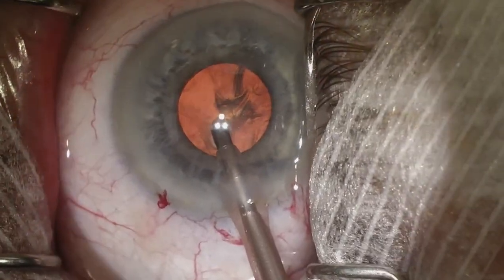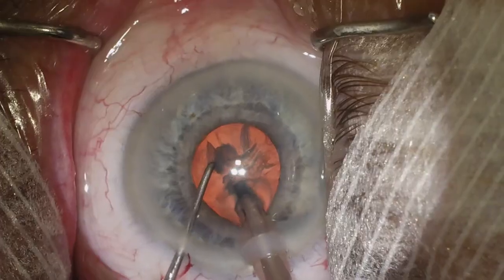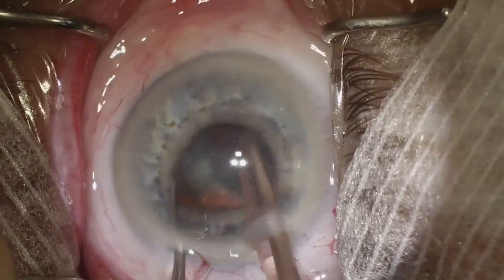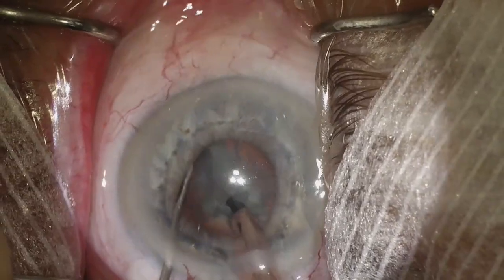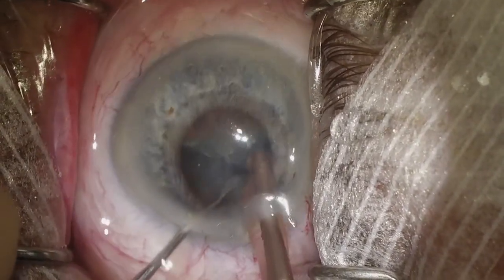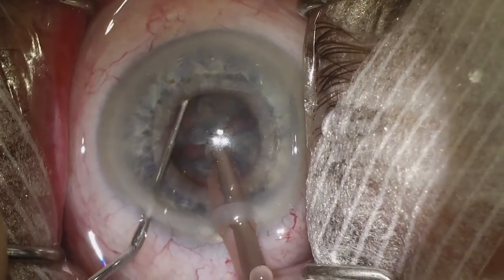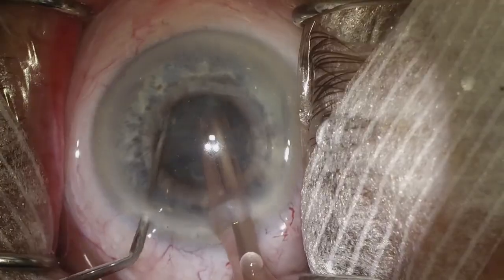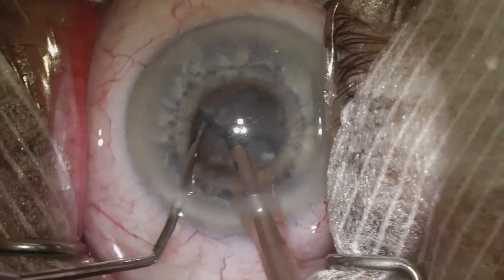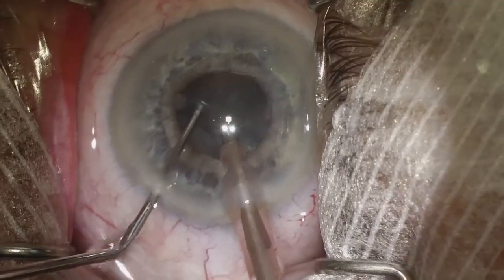Then we go in with our phaco probe and proceed with our phaco chop technique — I do a horizontal chop. The nice thing about phaco chop is it does allow you to more readily do small pupil cases because you're not making a groove with the phaco probe and you're reaching underneath the anterior capsule with your second instrument. So you really don't need a huge dilation in order to do this comfortably.